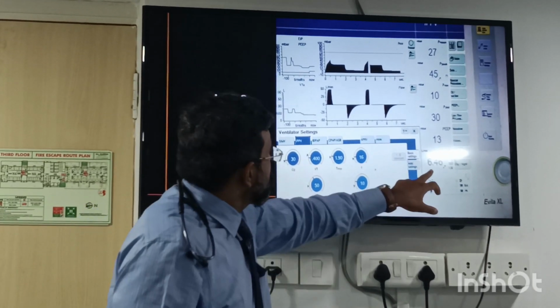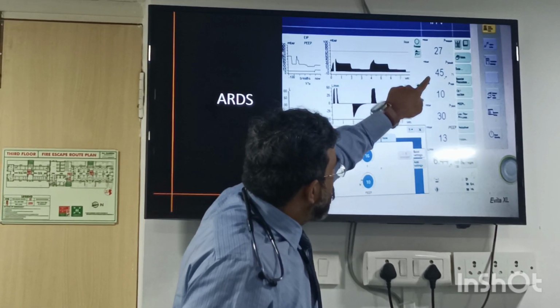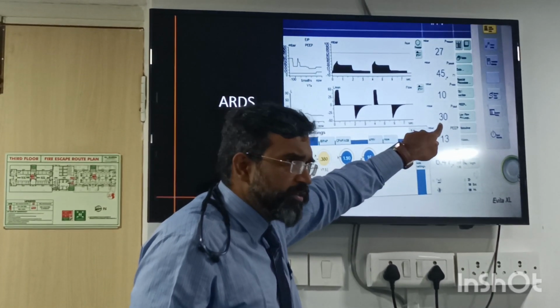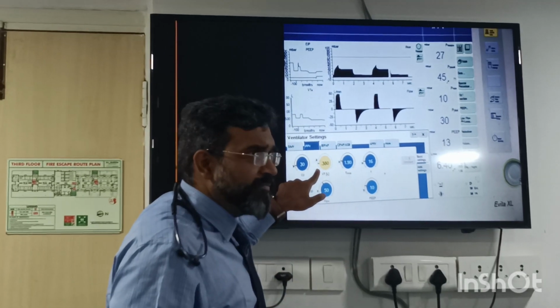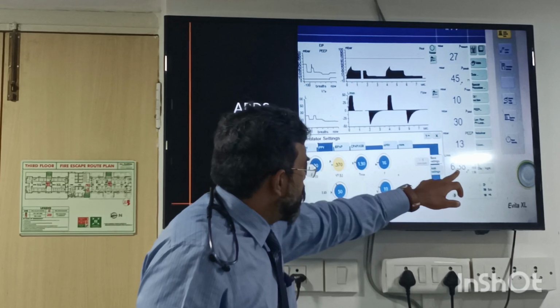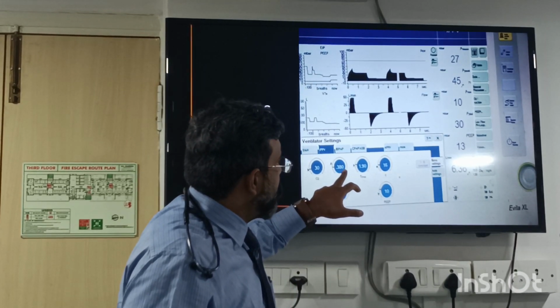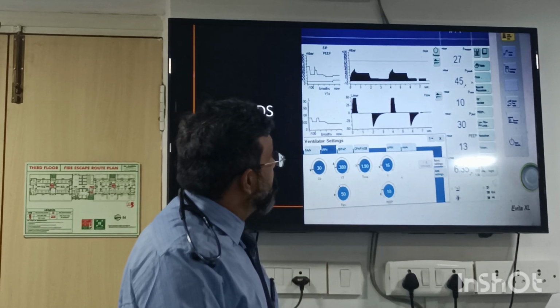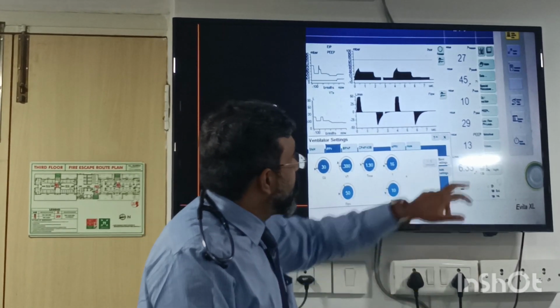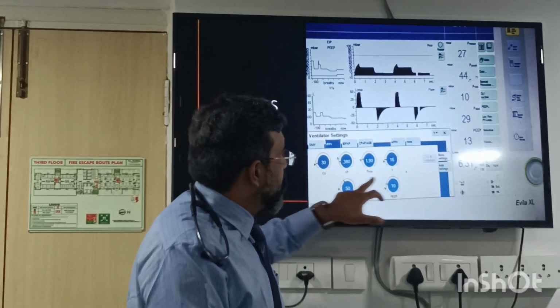Okay, I have got to 6.46. I have my peak pressures to be 45. I have my plateau at 30. I want to reduce it further. As I told you, I am happy with lower. So I am coming lower to 380. When I come to 380, I am setting the 380 and seeing what is happening to my minute ventilation. In fact, 370 I got. Okay, I got to 370 and I am checking what is happening. Mean pressures are 27. My plateau pressures are around 29 now, going down. I have achieved this kind of plateau pressures.